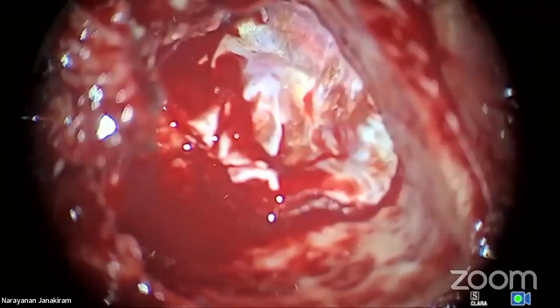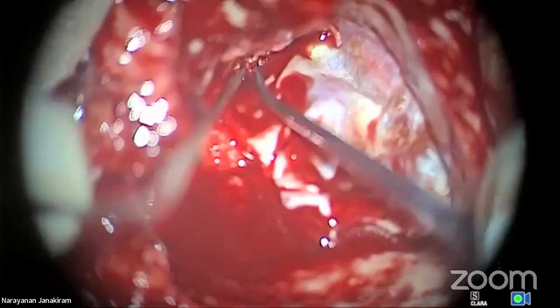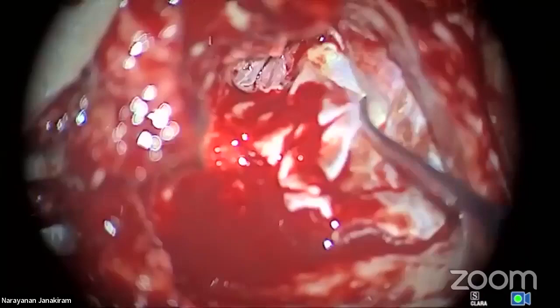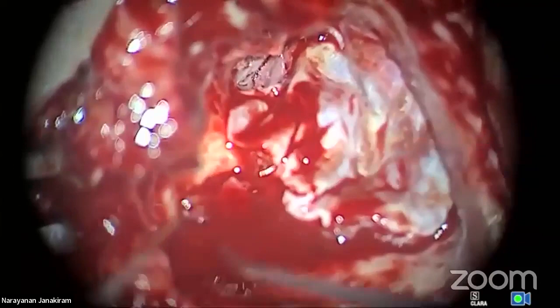How was it, Dr. Sandeep? You liked it? See, easy way of doing all this. Now I'm going to take off this cotton ball. You can see. Take off this for me. Now that is the impression by the columella. Don't worry. Now keep gel foam here, Deepak. Now can you give me the other soft tissue? This soft tissue I can keep here.